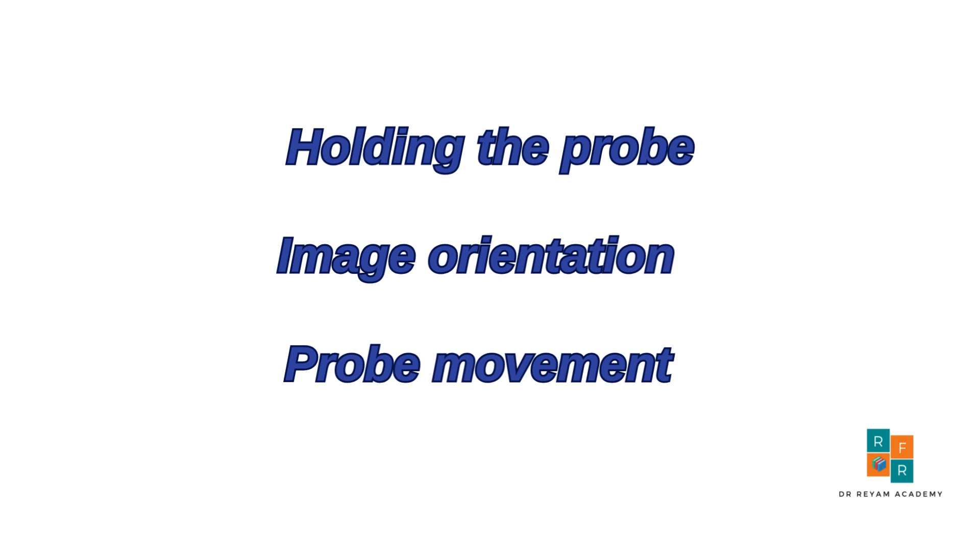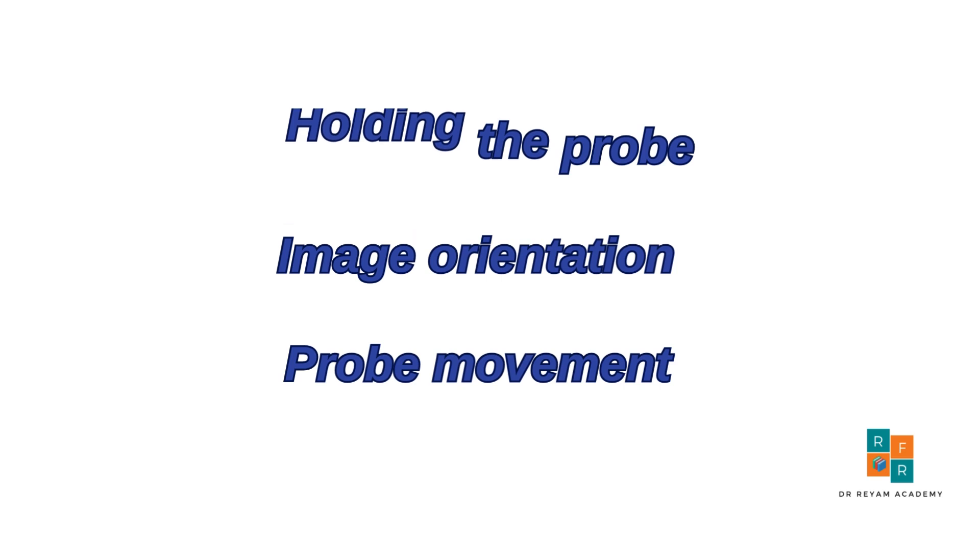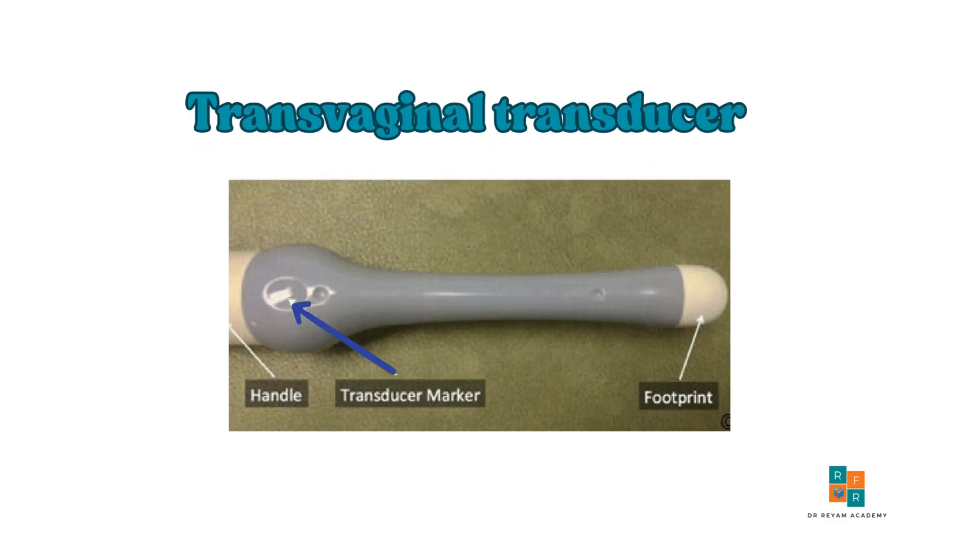Let's take a closer look at the transvaginal probe itself. The transvaginal probe is shaped like a long cylinder with a handle and small footprint at its tip. Most importantly, it features a marker such as a notch, typically located on the dorsal side near the handle. This marker is essential for determining the probe's orientation during scanning.